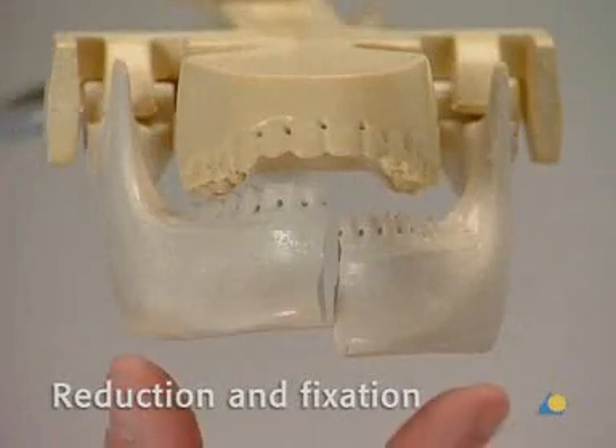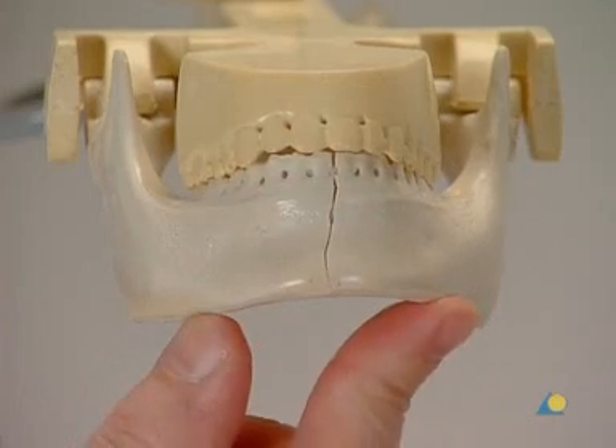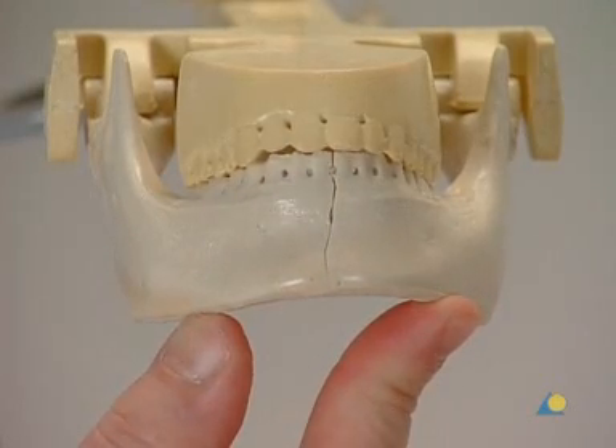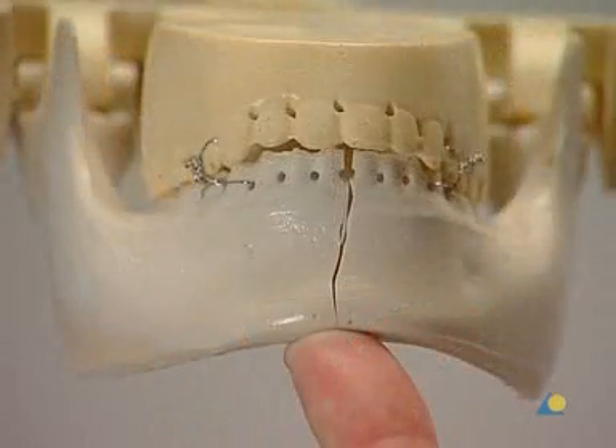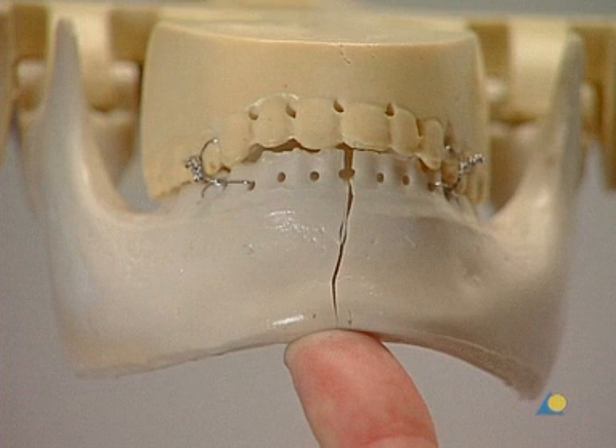Before open reduction and fixation in the dentate patient, the correct occlusion must be re-established. For this exercise, Ernst ligatures have been selected to hold the occlusion. However, it should be noted that many surgeons prefer MMF with arch bars because of the increased stability.